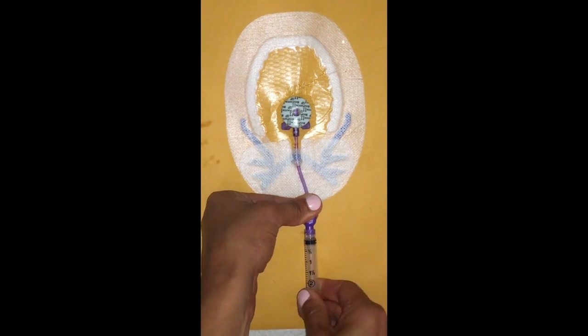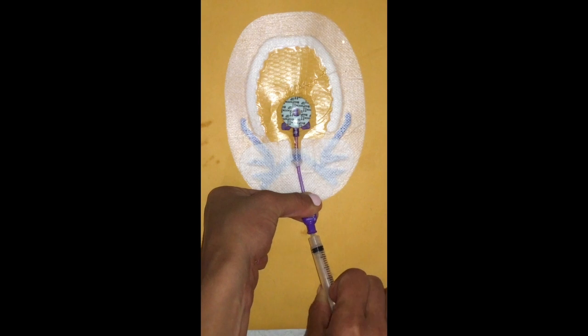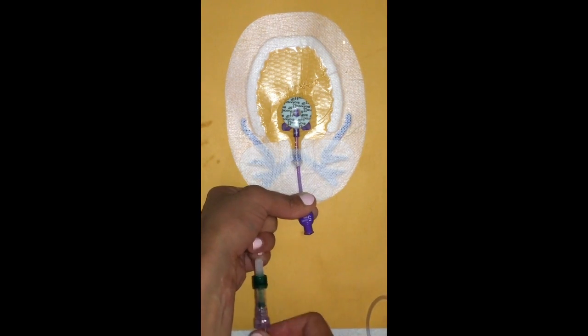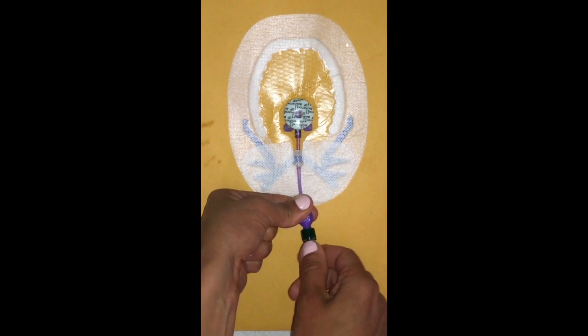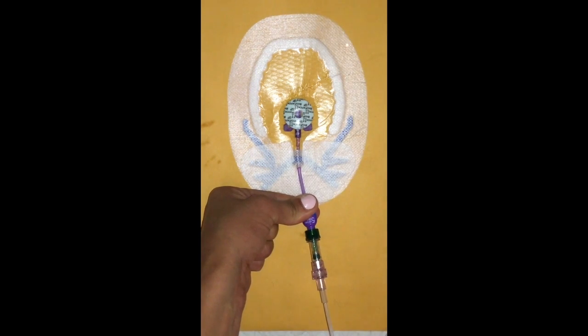Once you've done that, and you've programmed your pump and primed your pump and the line and the cap, you will take the cap at the end of your tubing here. Again, this has all been primed with the medication, so this attaches right on. And once you start your pump, the patient will begin getting the infusion almost immediately or shortly thereafter because you've already primed the line.